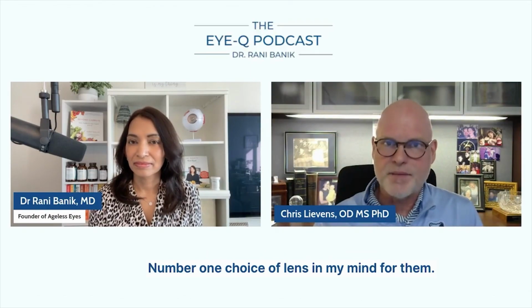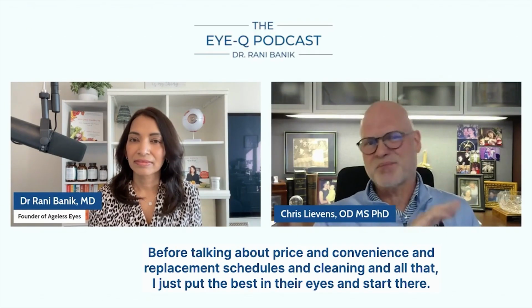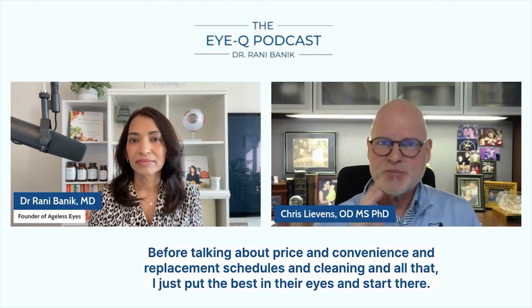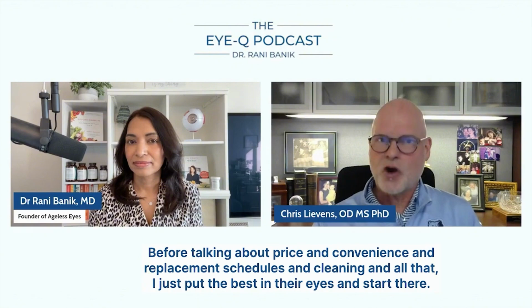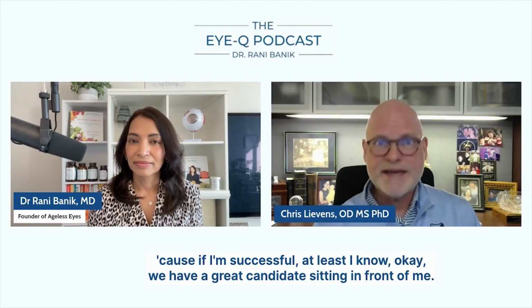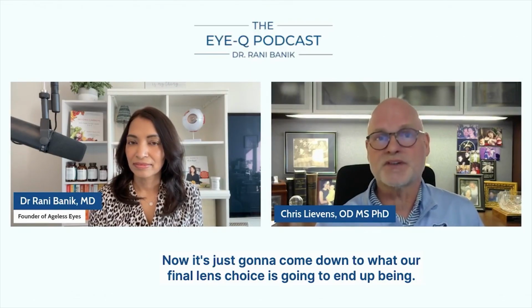And all this time, my wheels are spinning on what is the number one choice of lens in my mind for them. And I usually present them with the best first. Before talking about price and convenience and replacement schedules and cleaning and all that, I just put the best in their eyes and start there. Because if I'm successful, at least I know, okay, we have a great candidate sitting in front of me. Now it's just going to come down to what our final lens choice is going to end up being.